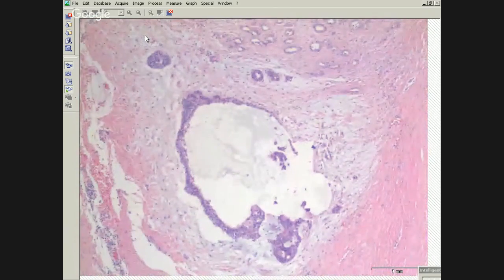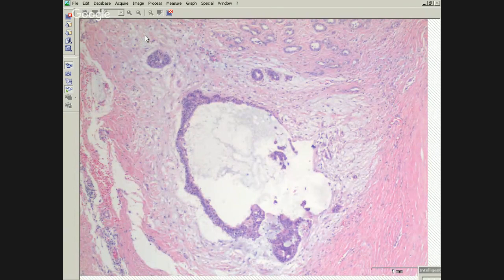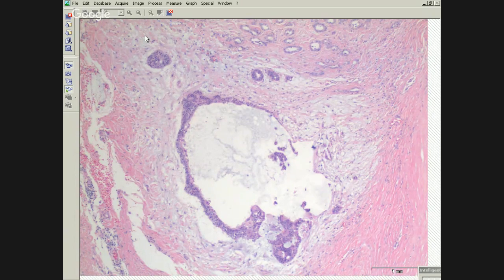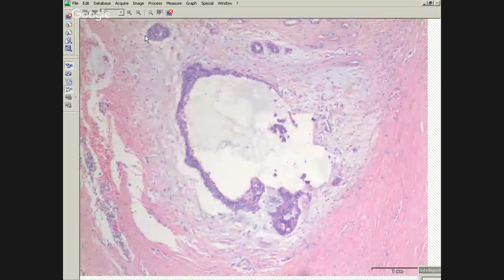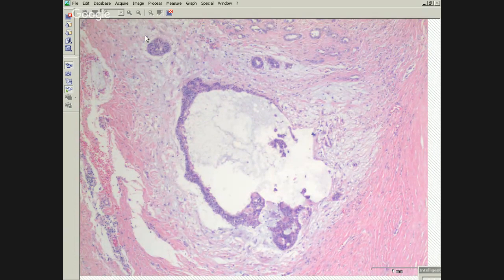But this kind of case often just gets sent in as adenocarcinoma without somebody having done any stains, because this does indeed look like mucin. But this is actually a mesothelioma that's producing a lot of hyaluronic acid matrix. So this is not mucin. The point of this case is that you always need to do your stains when you have a pleural biopsy, particularly with the distribution of multiple pleural nodules or diffuse pleural thickening, because this is actually hyaluronic acid production.